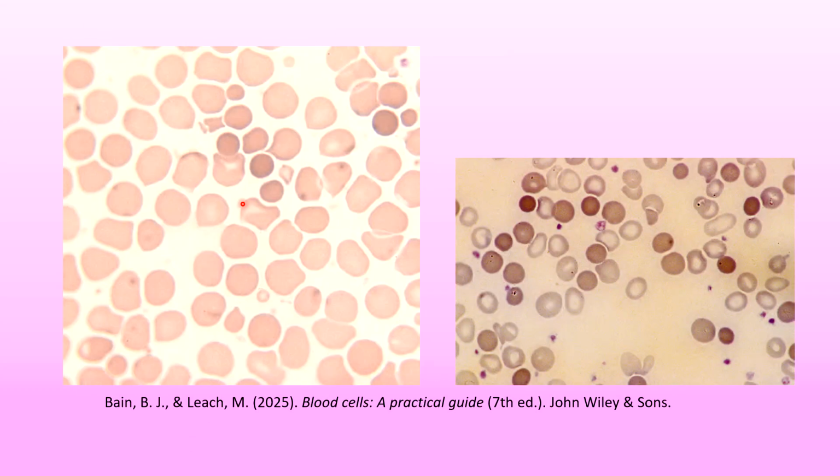This is a blood film of a patient who has undergone burns, and these are the spherocytes that you're able to see. So they are sort of rounded off. The microspherocytes are red cells that appear to be budding off. Very small spherocytic fragments are also seen here and there, which are snipped off by the splenic arterioles. Not very dissimilarly, there is an artifact that is produced by in vitro heating also.